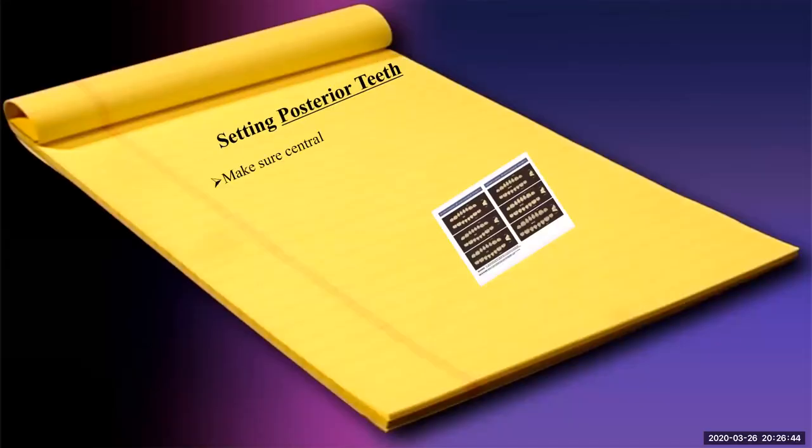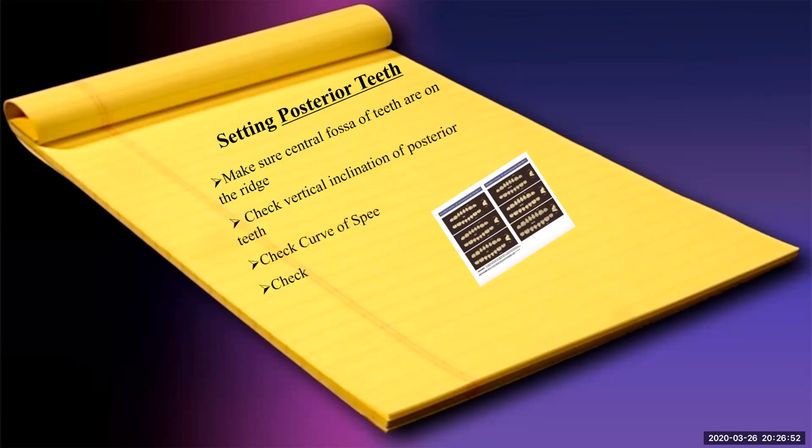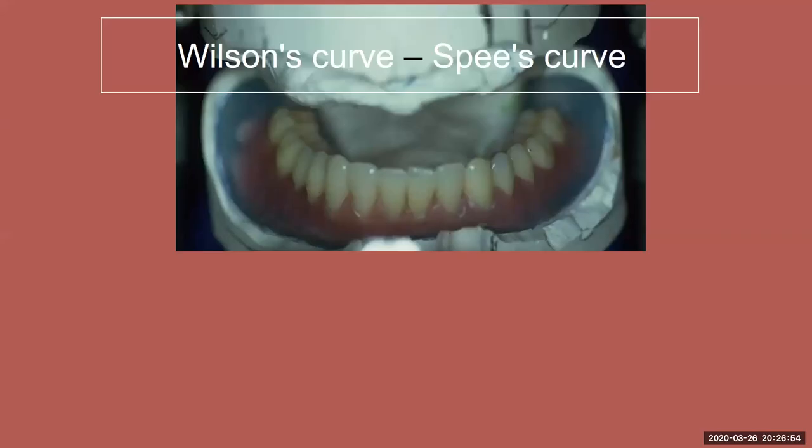And so let's check our setting of posterior teeth. We want to make sure the central fossa of the teeth are on the ridge on the lower. We want to check our vertical inclination, our Curva Spee, and our Curva Wilson. And just to check real quick, this is our Curva Wilson from the buccal to the lingual, and Curva Spee from the anterior to the posterior.